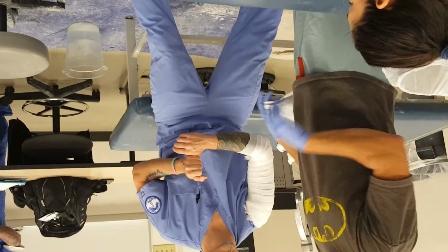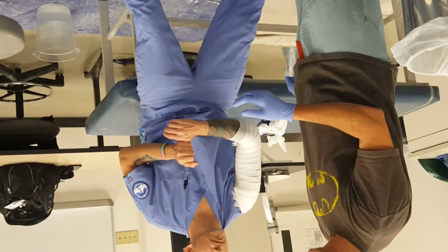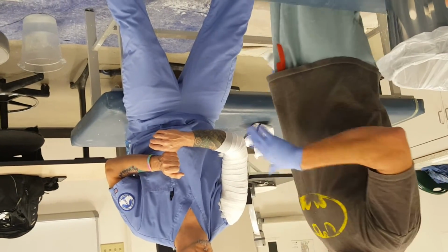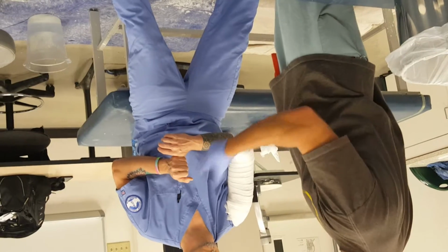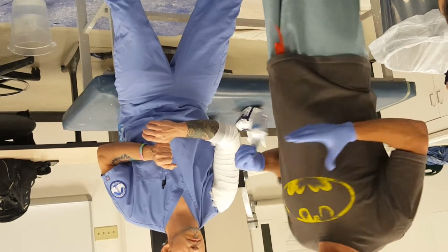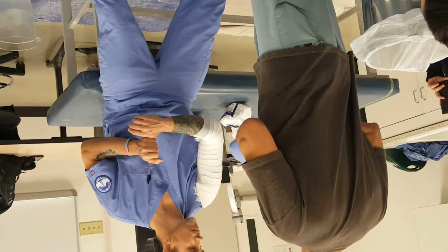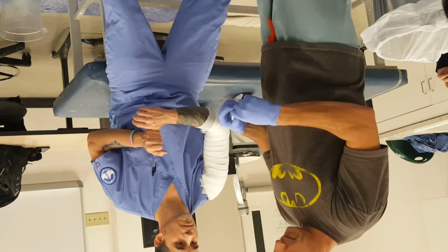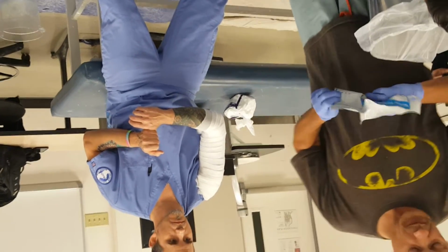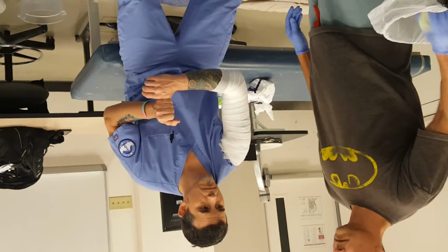Now, why use this? Compliance is the big issue here. The other thing is those fracture braces don't necessarily fit everybody. You haven't put enough braces on to really tell that, but as time goes on, you're going to find some of these braces that are off the shelf, they fit 90% of the population, but there's 10% that just doesn't fit. Talking about like a real obese, really skinny. Exactly. This will be done in fiberglass too, people. Why? It's lighter.